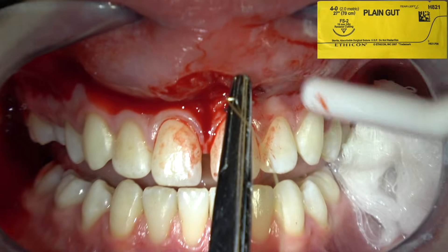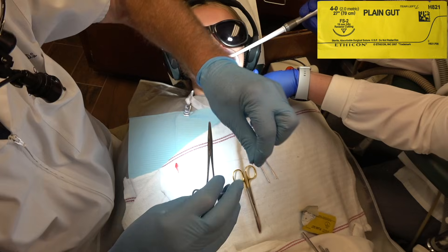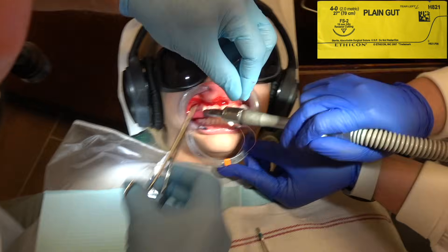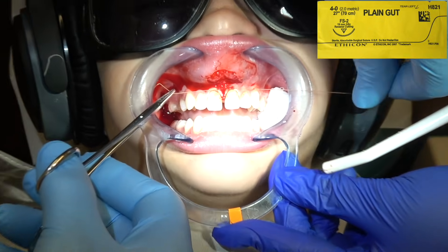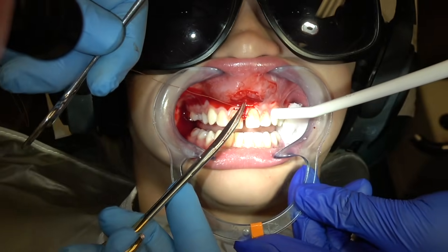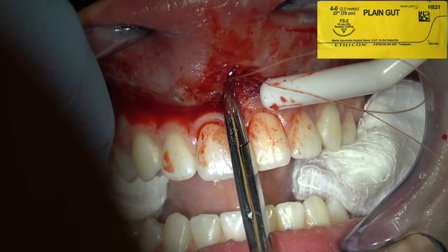I'm suturing this with 4-O plain gut suture. This attached gingiva is not going to pull together, but you want to go ahead and place the suture there just to have a little hemostasis. This is a fabulous patient — she's only about 10 or 11 years old and was just a real trooper. She didn't blink. Now when suturing, the first tie is away from me, and especially if it's 4-O suture, I'll go one, two, three, pull — then one toward me, pull — then one away from me, pull. You don't want to pull it and then it loosens. You want to keep it tight.